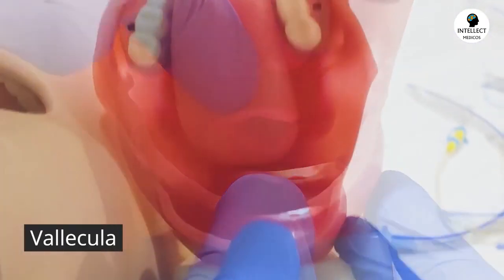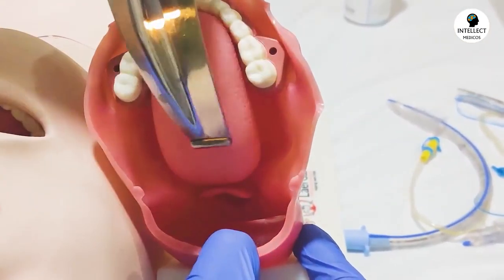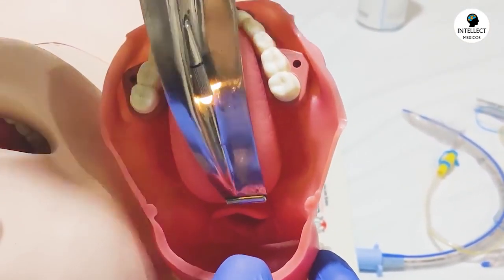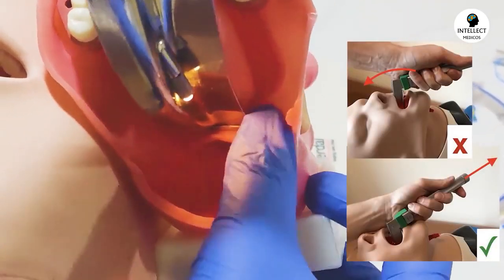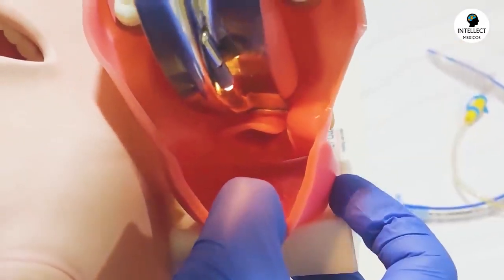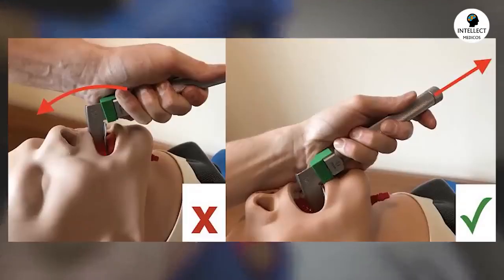I have to get the tip of my laryngoscope to the vallecula. So first of all, I'll go like this, deviate the tongue, and I'll go over here. Now the movement of my laryngoscope should be like this, as shown in this pic.